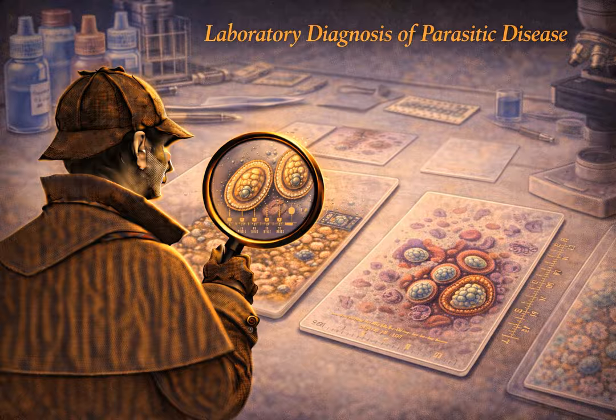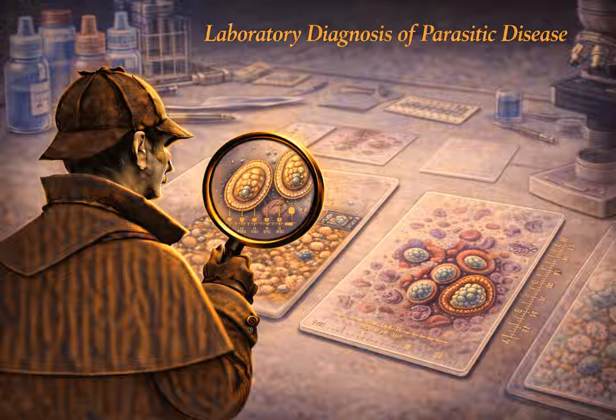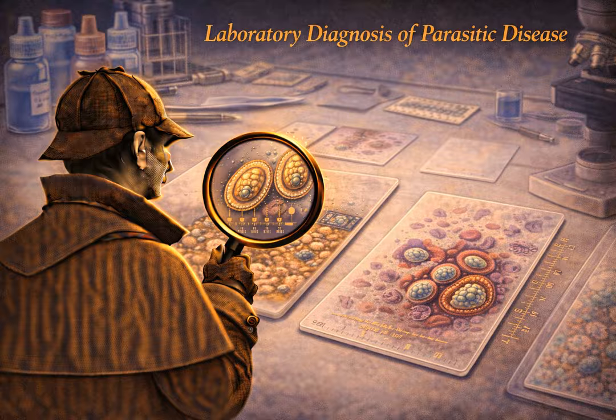Wow. Now, Murray throws a massive red flag right here in the text. A standard O&P exam, even with the trichrome stain, does not detect everything. There are invisible pathogens. This is a classic board exam trap and a very real critical pitfall that harms patients. A standard trichrome O&P will absolutely not detect Cryptosporidium or Cyclospora. Wait, why not? They are intestinal protozoa, aren't they? They are, but they are incredibly small, much smaller than Giardia. And more importantly, they simply do not take up the trichrome stain well at all. On a standard slide, they just look like empty ghosts or generic background debris.